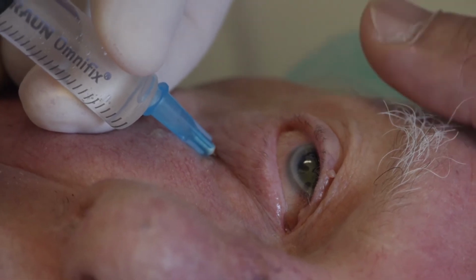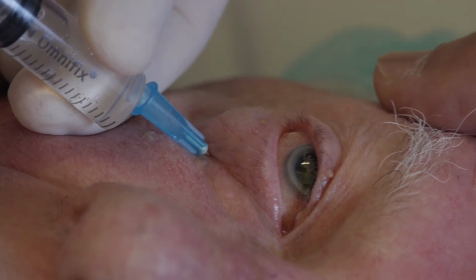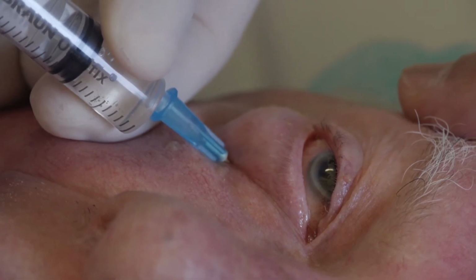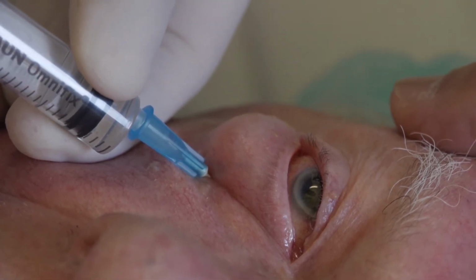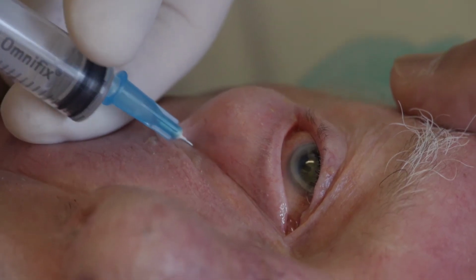There should be no resistance to the injection. As you can see, the upper eyelid starts to come down quite quickly, and there's a little bit of lateral swelling and chemosis consistent with the peribulbar block. So you inject. I like to go for 4.5 or 5 mils of 2% lignocaine. Obviously it depends on the exact surgery we're doing.